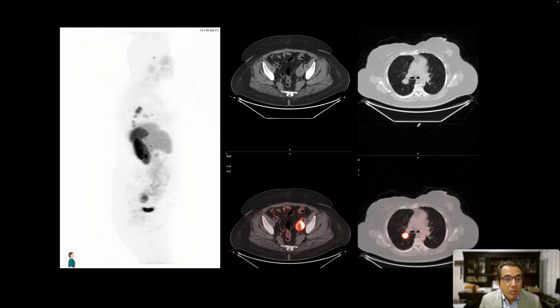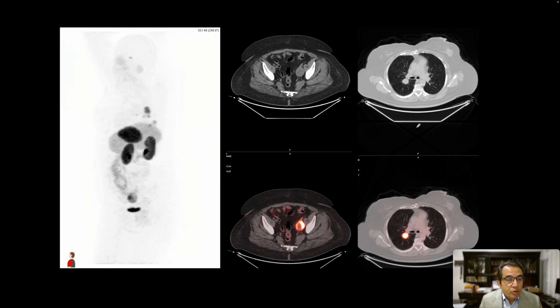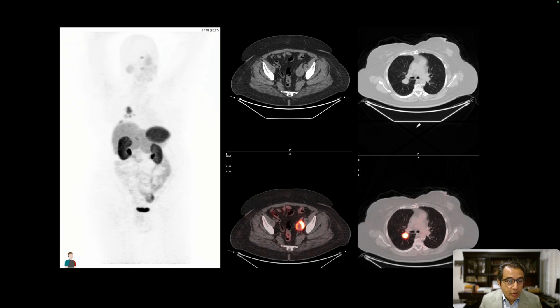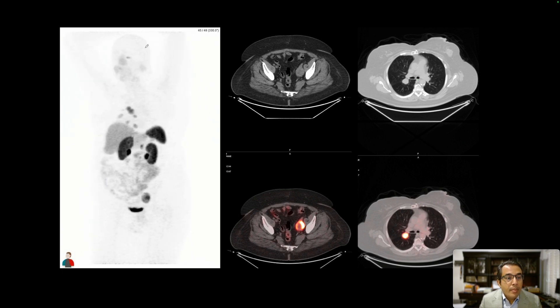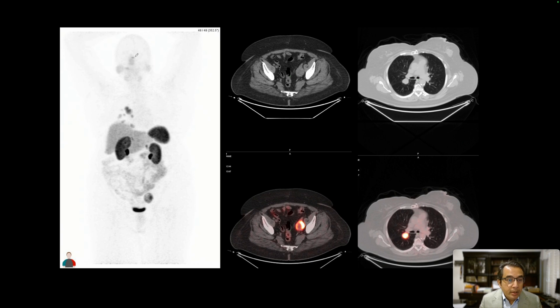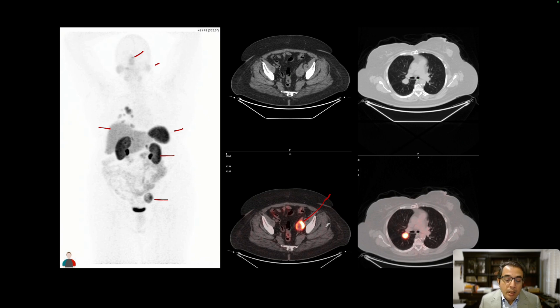A DOTATATE PET-CT was performed. The rotating image on the left shows physiologic distribution of the tracer: uptake in the pituitary, salivary glands, spleen, more intense in the liver, and excretion from the kidneys into the urinary bladder. We see a focus in the left side of the pelvis, which corresponds to a metastatic lymph node on the fused image.